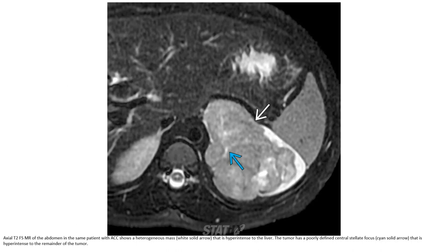This is a T2 fat-saturated MRI of the abdomen in the same patient with adrenocortical carcinoma, showing a heterogeneous mass that is hyperintense to the liver. The tumor has a poorly defined central stellate focus that is hyperintense to the remainder of the tumor.